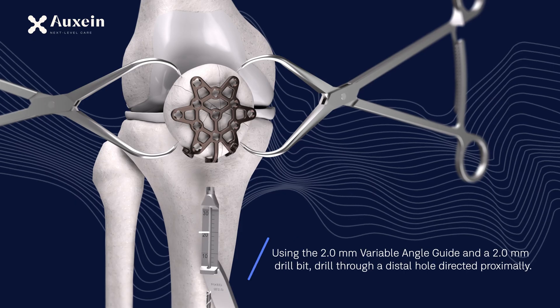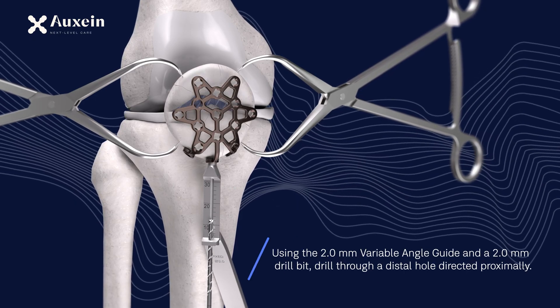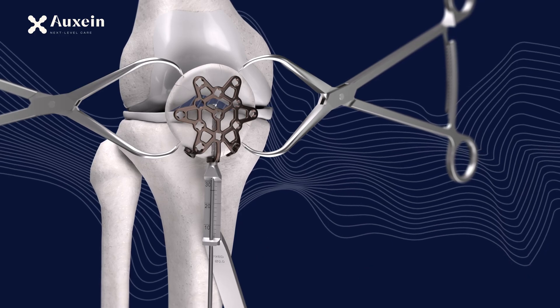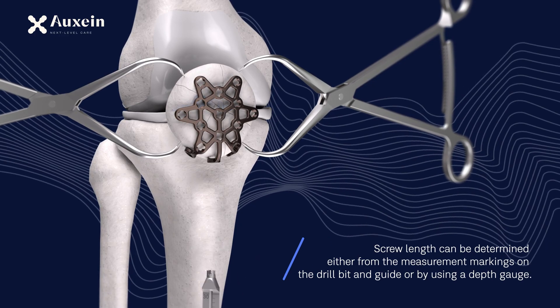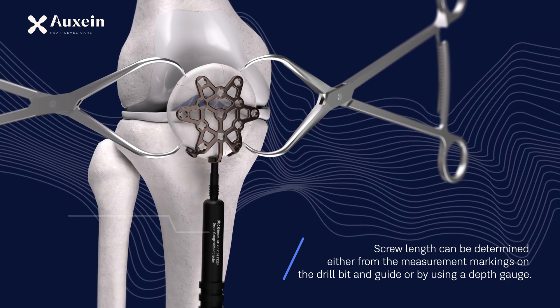Using the 2.0 mm variable angle guide and a 2.0 mm drill bit, drill through a distal hole directed proximally. Screw length can be determined either from the measurement markings on the drill bit and guide or by using a depth gauge.